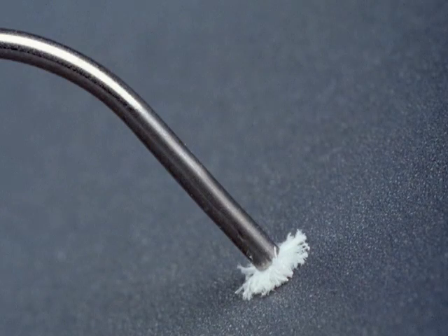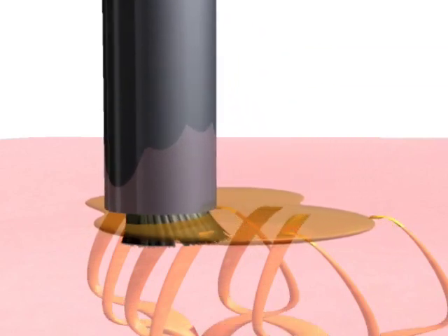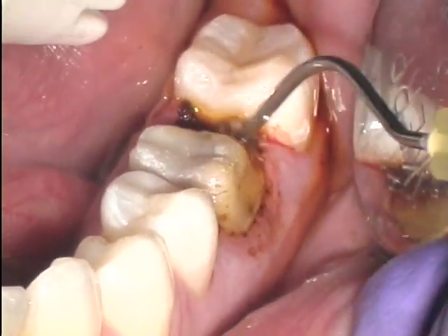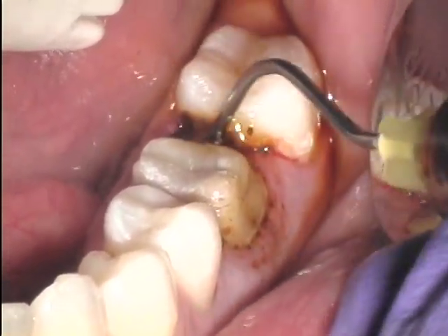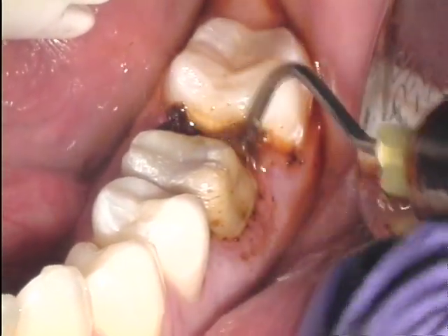The Dento Infuser was developed by Ultradent to permit the infusion of the hemostatic solution into the cut capillaries. The hemostatic solution is rubbed firmly against the bleeding cut tissues until bleeding stops. The rubbing motion also wipes off excess coagulum, making it even with the cut tissue surface.